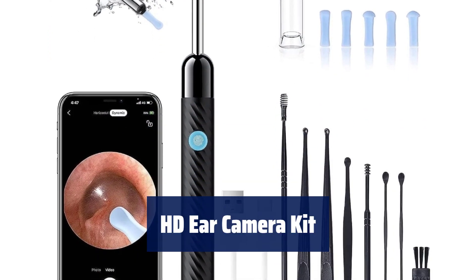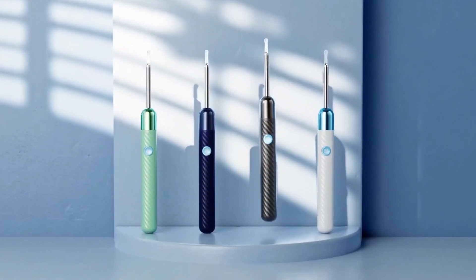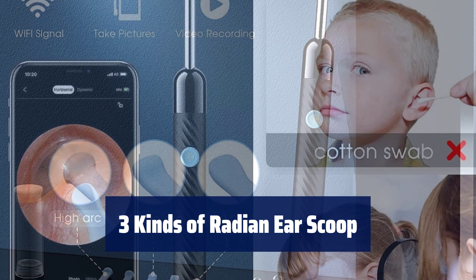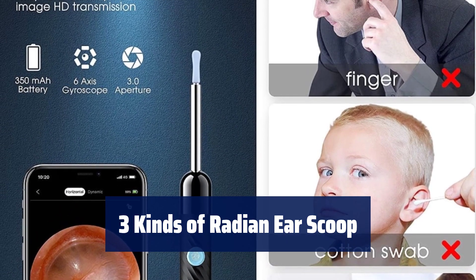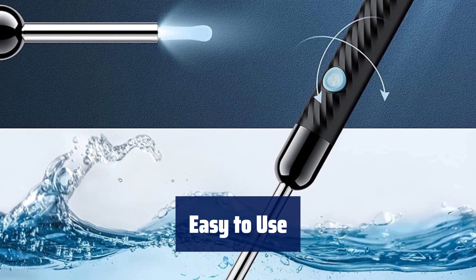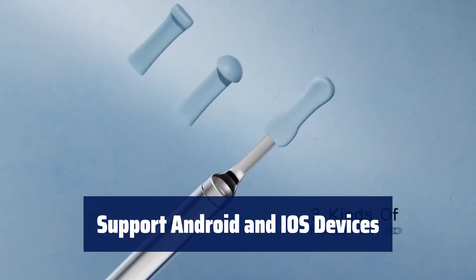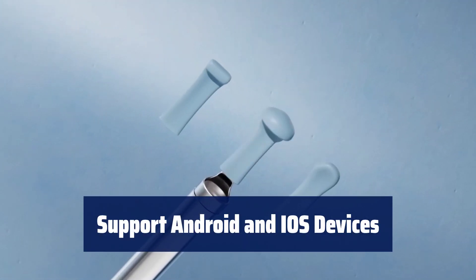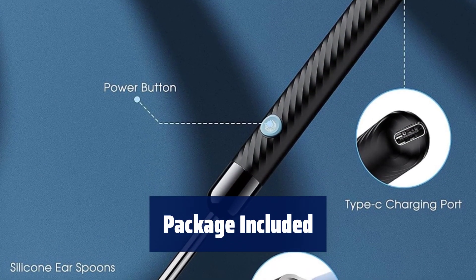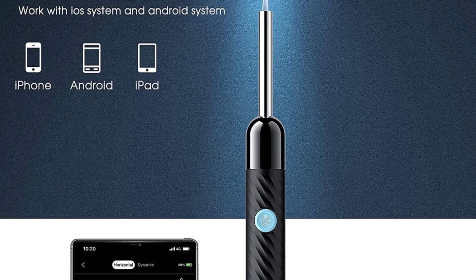Number 3: See and clean earwax effectively with 6 LED lights and an HD camera. Temperature close to body temperature. Choose the curvature that suits you. Use a silicone cover to prevent scratching. 350 mAh rechargeable battery with 90 minutes of usage after a full charge. IP67 waterproof and easy to clean after use. Download the app and connect the camera through Wi-Fi to start using. Photos and videos are stored in the app album. The kit includes the earwax removal tool with light, silicone earplug cover, charging cable, and instruction manual.